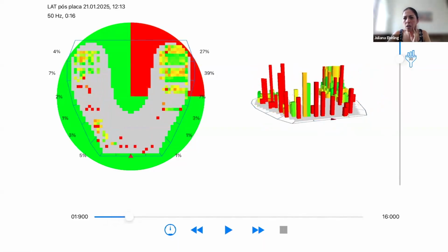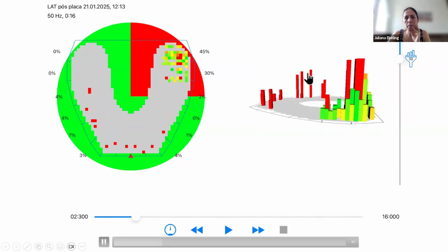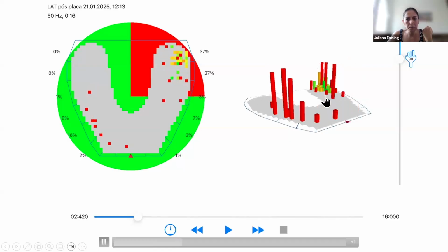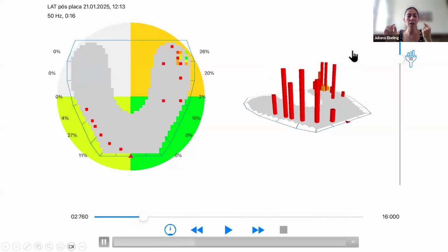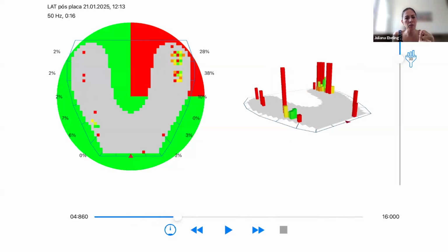And then the patient goes to the right side, but we keep the balance side contact during the movement. This is very, very helpful because I can check if we have balance contact in the balance side and what the intensity of this contact is and how long these contacts last during the movement.